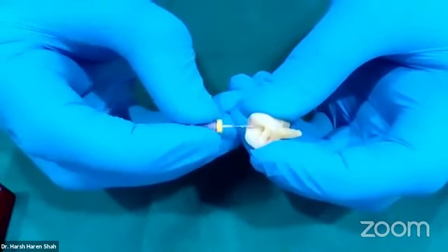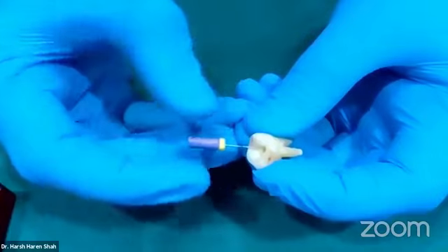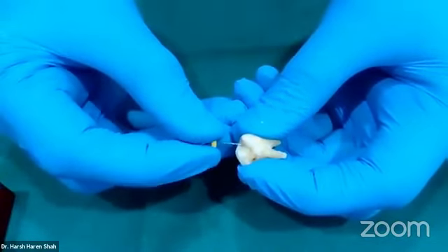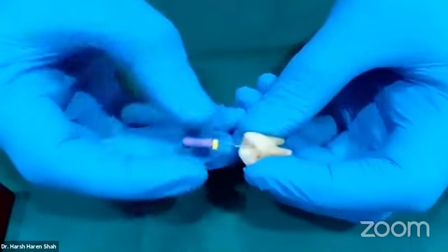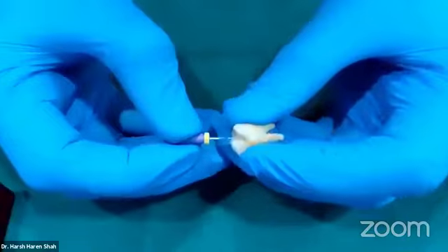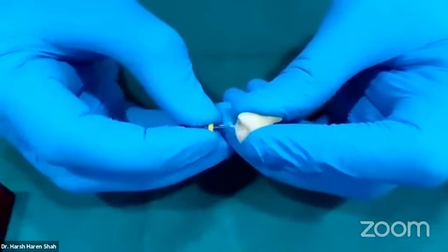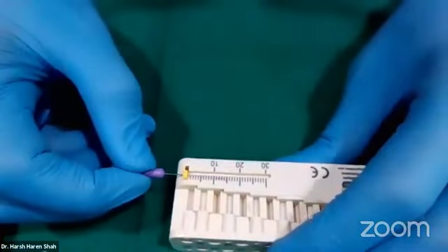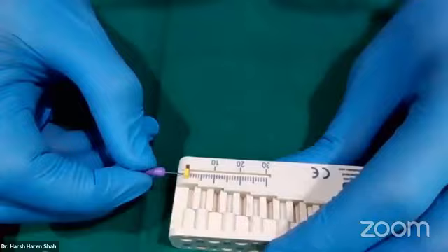So we go clockwise, counterclockwise. We do not apply too much apical pressure, but slight apical pressure is essential here. So yeah, now I can see my file coming out of the apex as well, which means that I have reached the complete length. My length should be roughly around 15 millimeters here. Let's just check. Yeah, it's 15. Yes, it's precisely 15 millimeters.